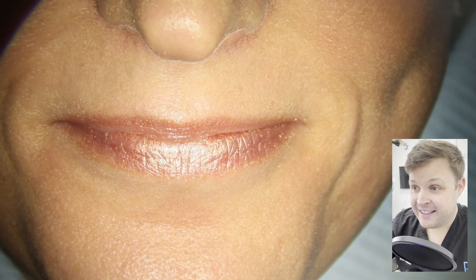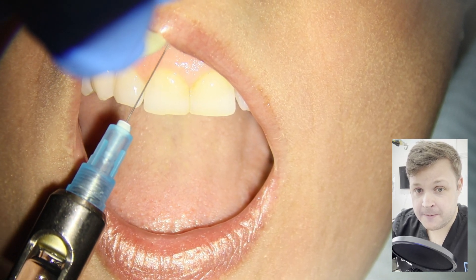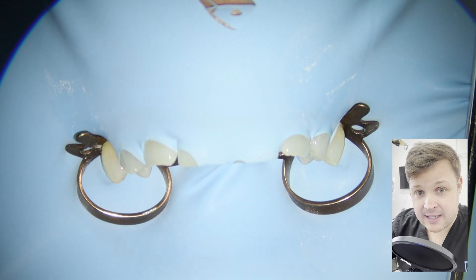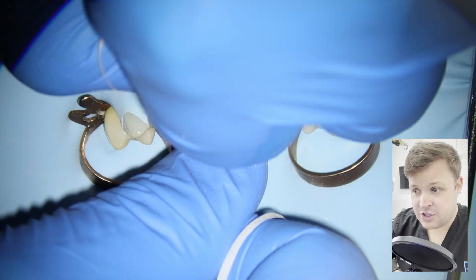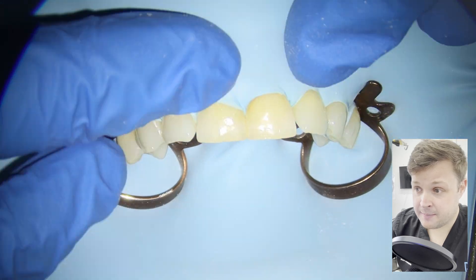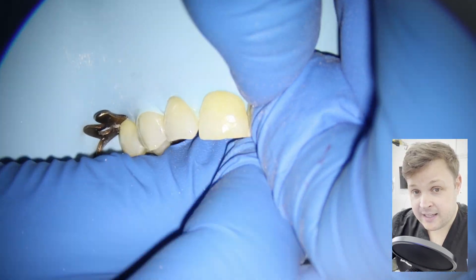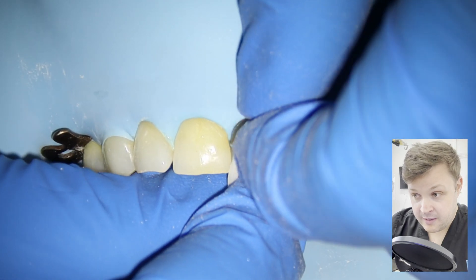Welcome. This is a video demonstrating composite fillings on two central incisors. I have many different ways of shaping the mesial and distal aspects of teeth — I've got Palodent, I've got Garrison, and one thing I use every now and again is just a clear mylar strip. Sometimes, or the vast majority of the time, it's not really great for getting a nice profile of the tooth, but on occasion — very, very rarely, like in this case — it can actually be quite worthwhile.